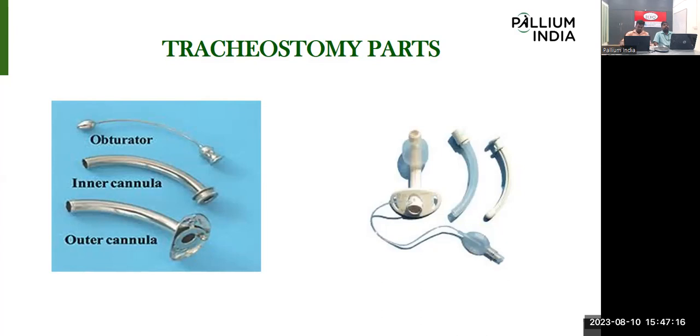Then this obturator we use as a guide only while doing the tracheostomy. While inserting the tracheostomy tube into the stoma, this obturator acts as a guide for insertion.